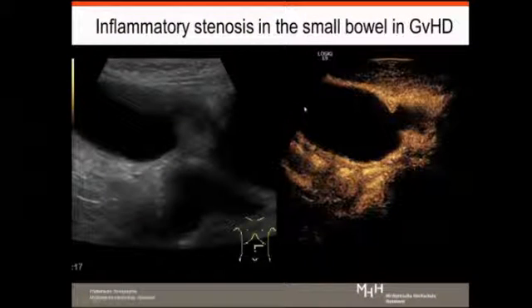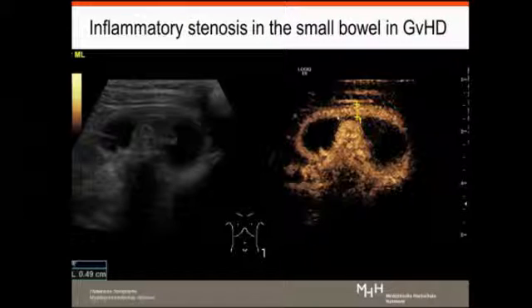And for example, here on the standing image, you could see a stenosis of the small bowel, and you see the dilated segment orally, and you could see the peristalsis going into it, and this is opening but slowly, and here is some sort of stasis. And here again, the inflamed bowel wall, and then here the stenosis.